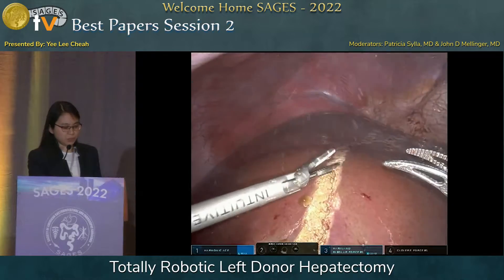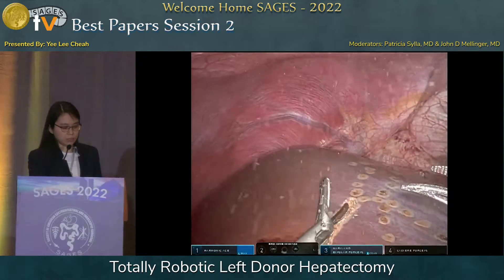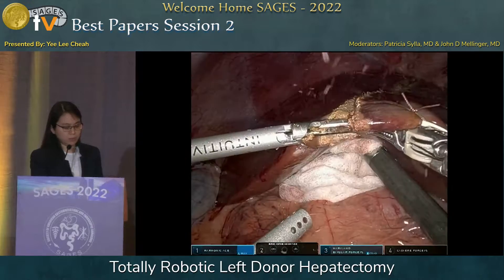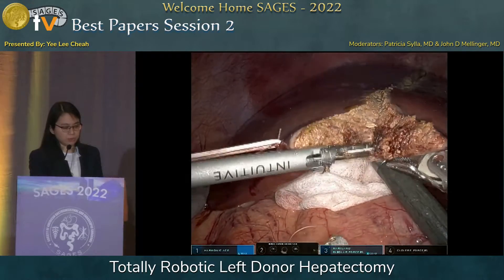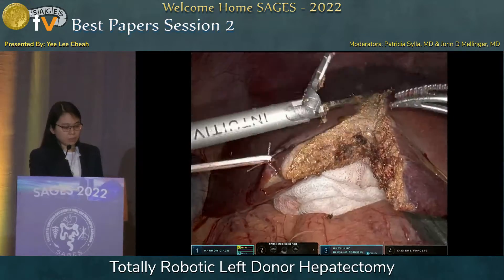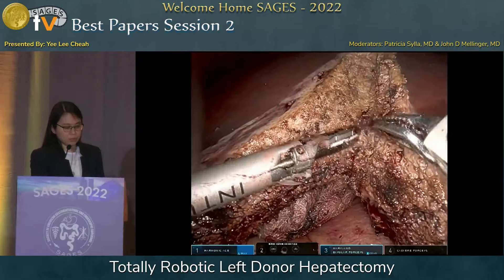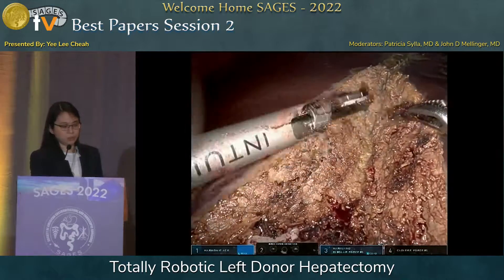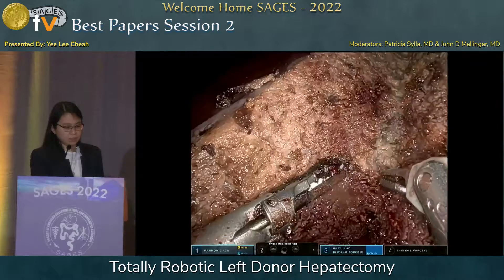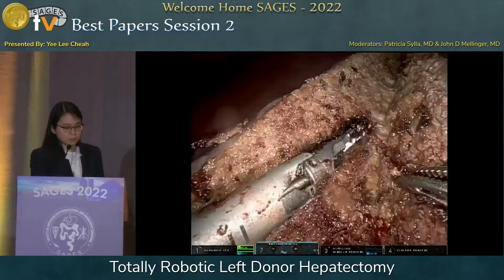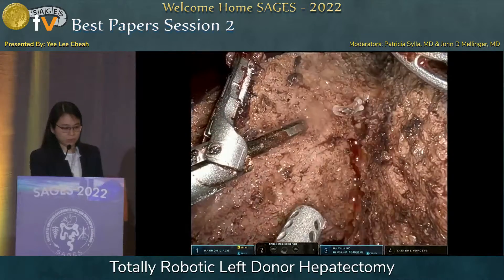Transection of liver parenchyma is performed by first inserting two rubber band retractions. The device we use for transection is a harmonic scalpel in the left hand and a Maryland bipolar forceps in the other hand, which has electrocautery. Small bleeders can be controlled with the Maryland bipolar. It is important that your anesthesia colleagues maintain the CVP at five or below because that will reduce bleeding. It may also be helpful to reduce the pneumoperitoneum to about 12 to prevent any gas embolism. This is very slow, meticulous dissection, but hemostasis is quite good if you are on the correct plane.